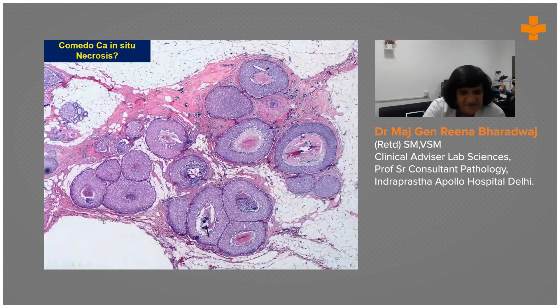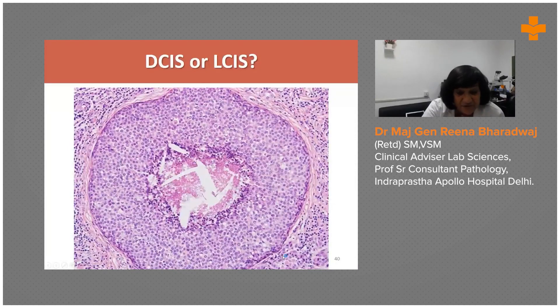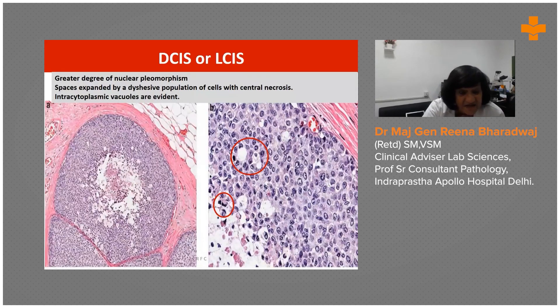Now let's look at this lesion. Again, the lobule is expanded and there is an element of some necrosis. Many of us would wonder: is this comedonecrosis or is it some form of LCIS? There is comedo-type necrosis but the cells are quite monomorphic. The higher power view shows the necrosis but the cells remain very monomorphic. When you find a greater degree of nuclear pleomorphism with spaces expanded by a dyshesive population with central necrosis, but you can see the intracytoplasmic vacuoles, you know that this is LCIS, which at times can show central necrosis.